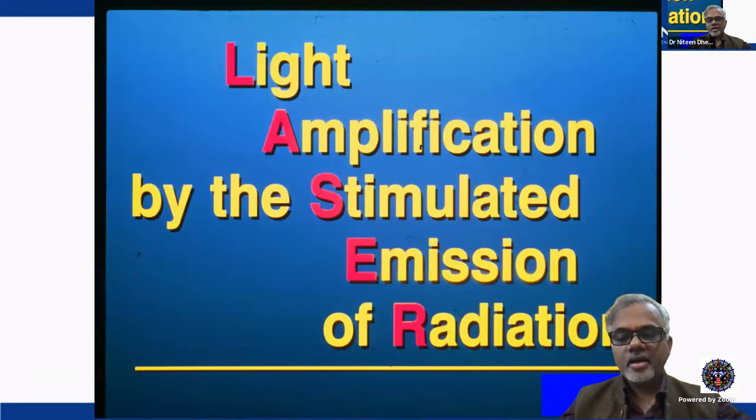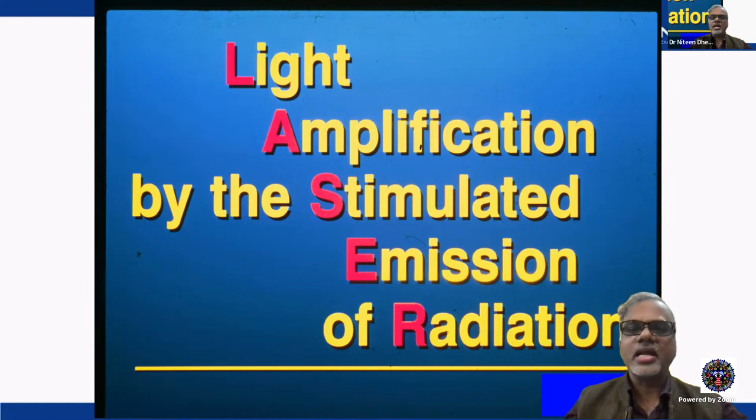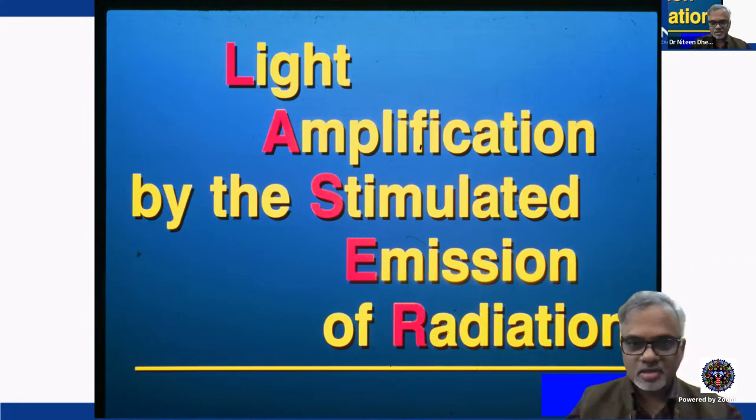Okay. Now coming to the lasers. So what is laser? It's an acronym of light amplification by stimulated emission of radiation. Here you have to understand three concepts in the five words. There is a light, there is a radiation. There are two processes you need to understand. One is light amplification and another is stimulated emission. We'll see one by one.